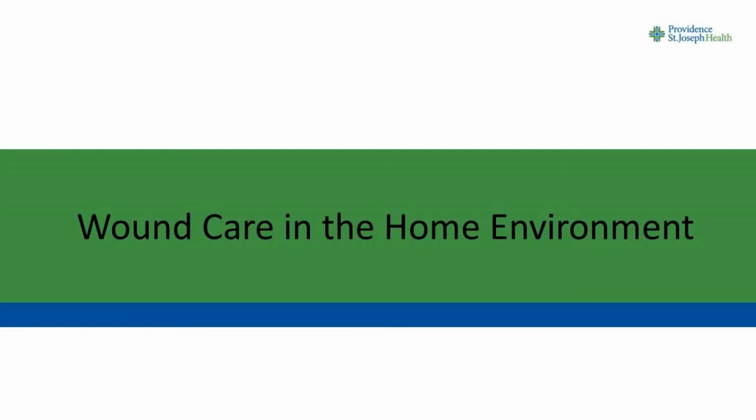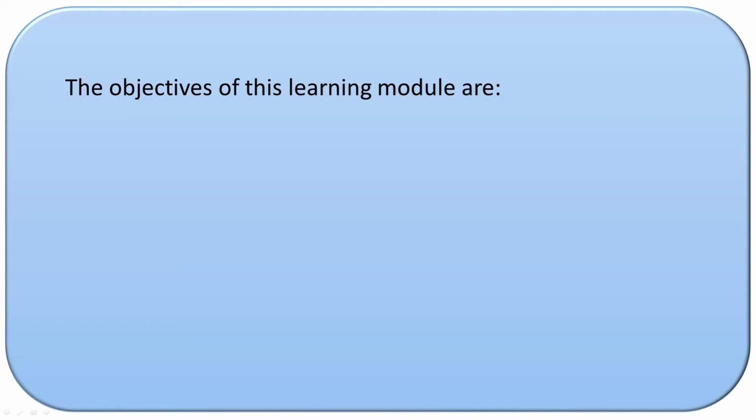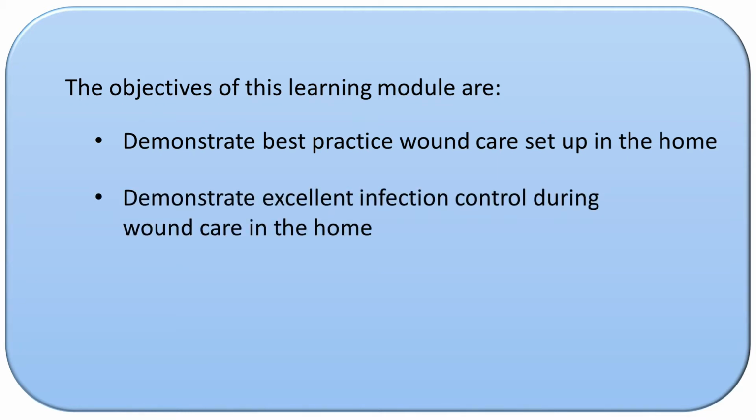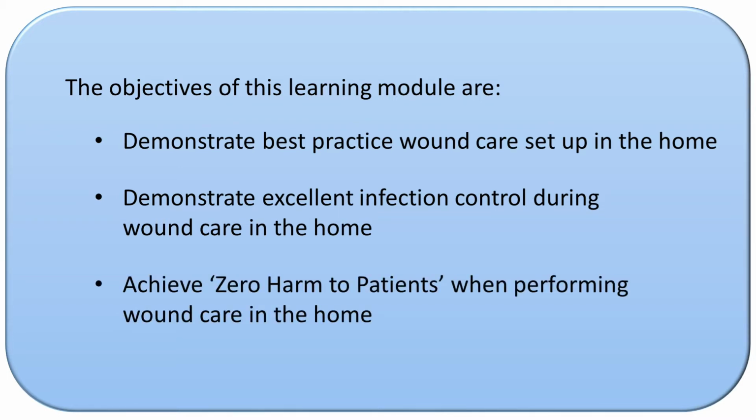Joseph Health Training video. Today's presentation features a brief review of wound care in the home environment. The objectives of this learning module are: demonstrate best practice wound care setup in the home, demonstrate excellent infection control during wound care in the home, achieve zero harm to patients when performing wound care in the home. The following is a visual demonstration of best practice wound care in the home.